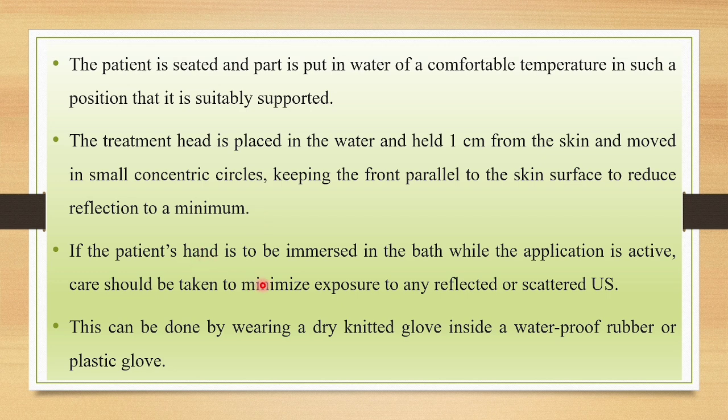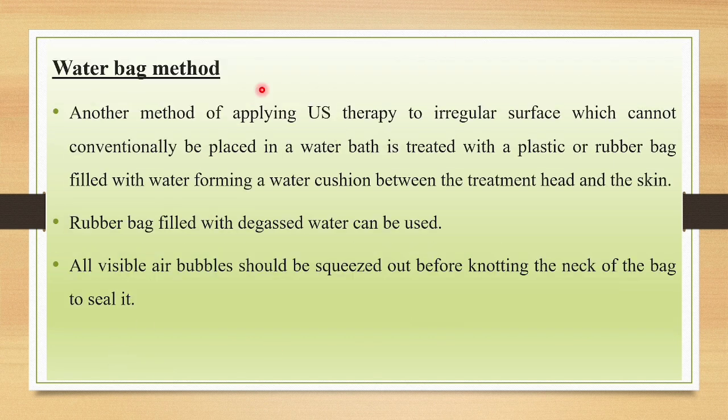If the patient's hand is to be immersed in the water bath while the application is active, care should be taken to minimize the exposure to any reflected or scattered ultrasound. This can be done by wearing a dry knitted glove inside a waterproof rubber or plastic glove. So the next method is the water bag method.